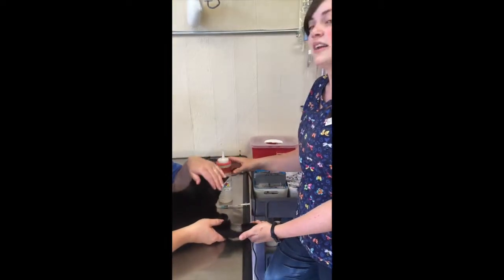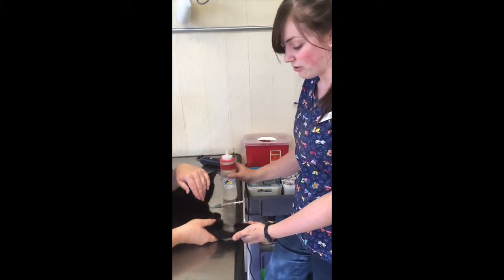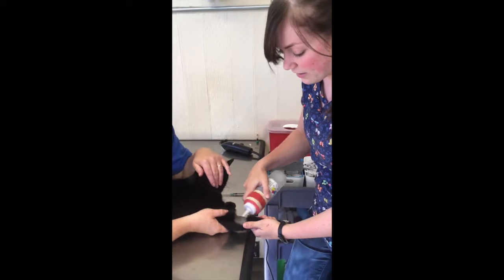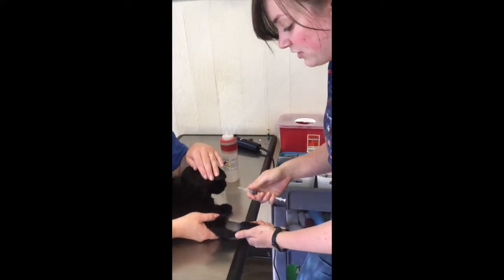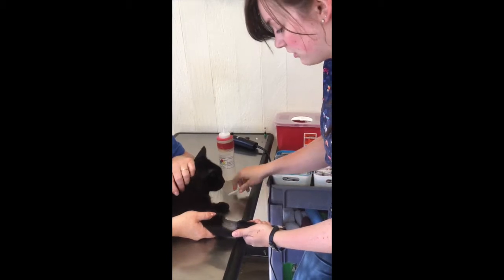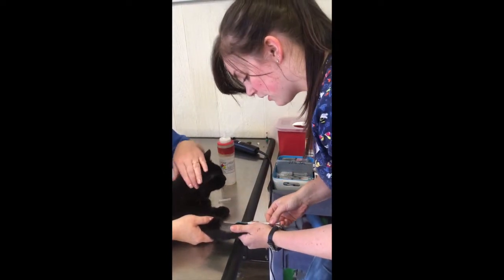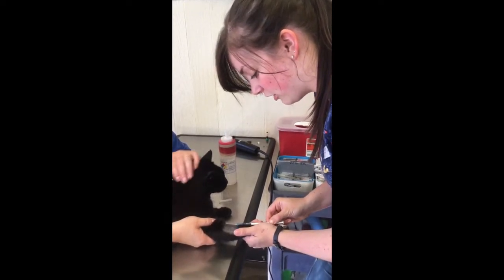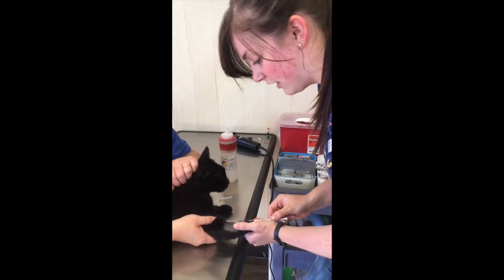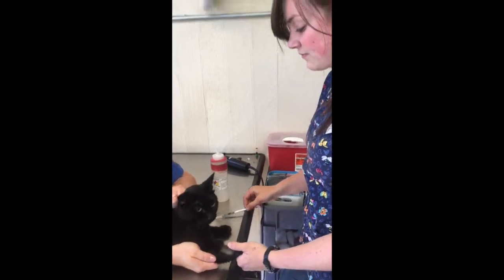Alright, I'm going to be drawing blood from the cephalic vein of a cat. So I have my syringe and I have my alcohol. I'm going to go ahead and apply my isopropyl alcohol. I'm going to remove the cap from my syringe. Make sure the bevel side is up. And gently insert the needle, pulling back on the plunger. Once I've gotten my sample, my assistant's going to let go of the pressure. I'm going to hold off. And we're done.